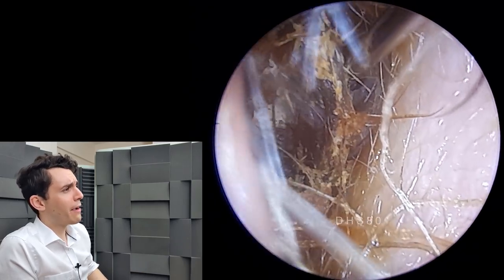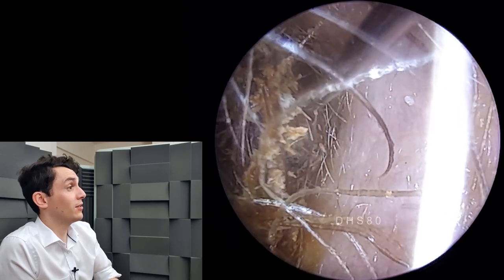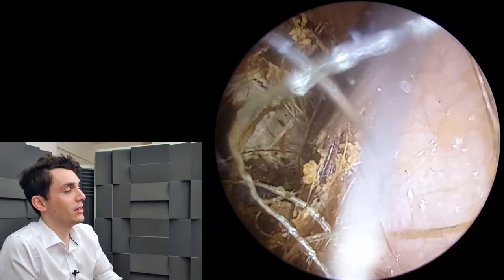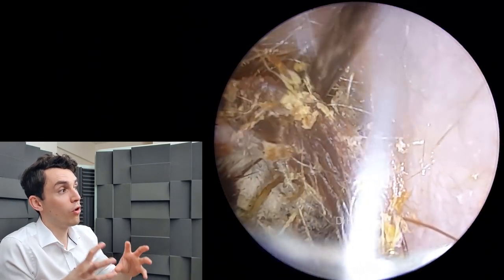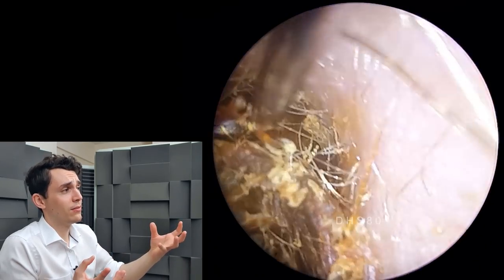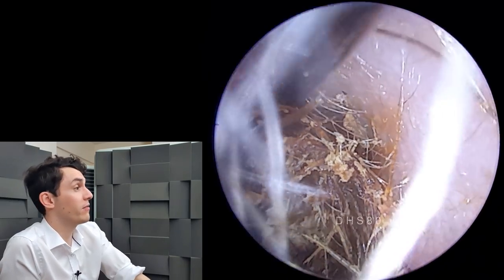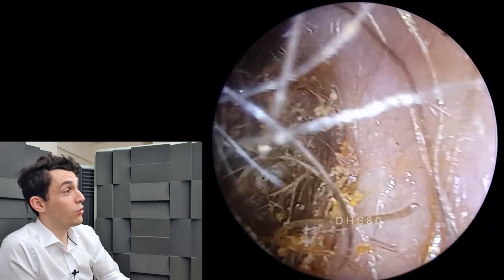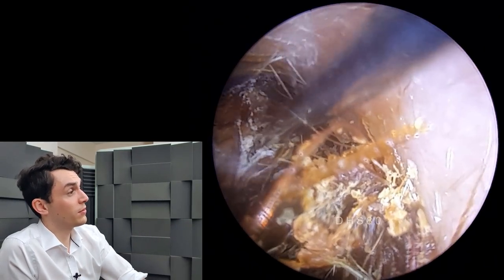I'm not quite sure how he managed to get it so deep, but essentially the tissue paper has acted as a pseudo-tamponade — it's probably absorbed a lot of the drops that he had applied. What we have here is just a very dry hair tissue paper matrix, which is very difficult to remove with suction. So I've gone in here with a cawthorn hook, which is fantastic for this type of job, and I'm just easing it out.